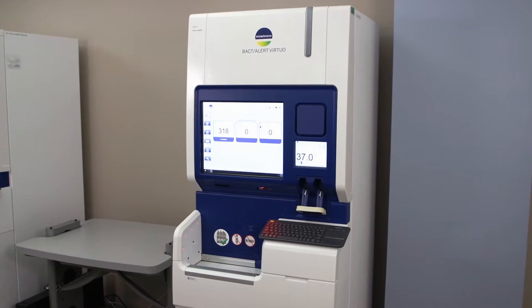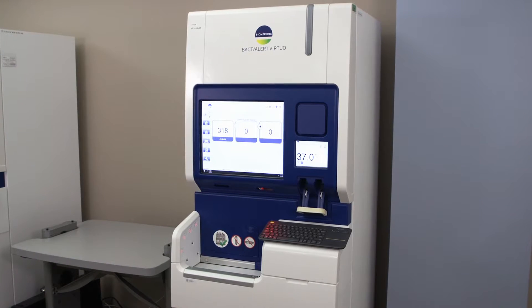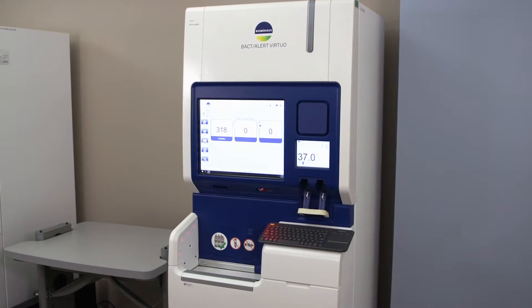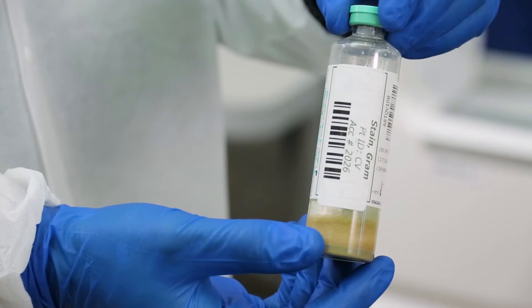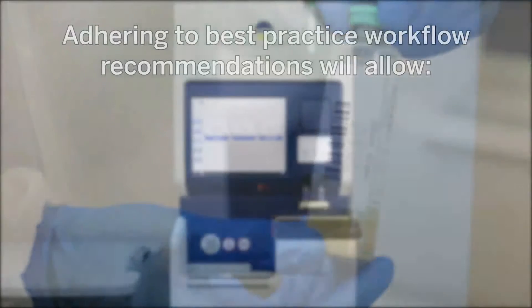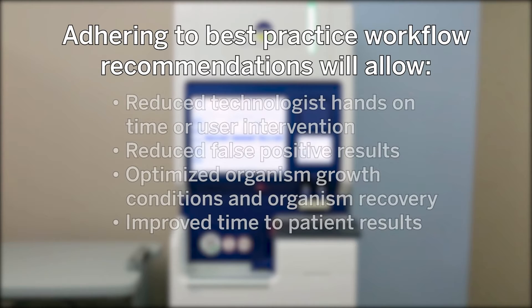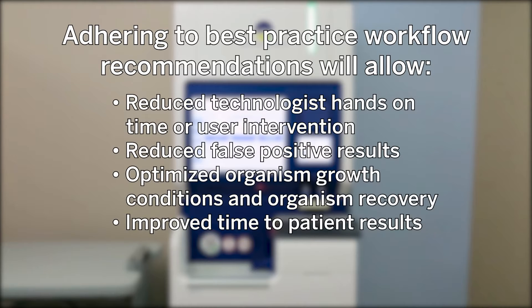The BactiAlert Virtuo instrument is an automated system for the incubation, agitation, and continuous monitoring of blood and other normally sterile body fluid or platelet samples for microbial growth. Adhering to best practice workflow recommendations will allow reduced technologist hands-on time or user intervention, reduced false positive results, optimized organism growth conditions and organism recovery, and improved time to patient results.